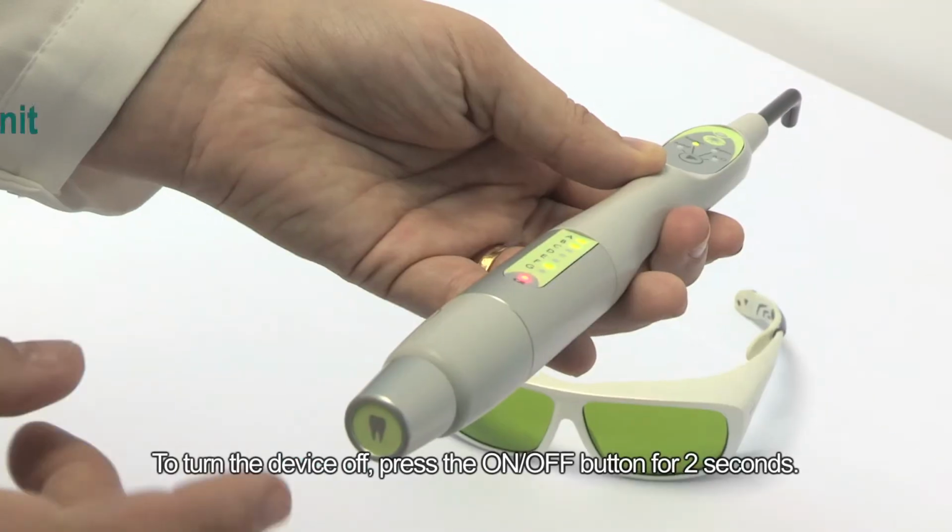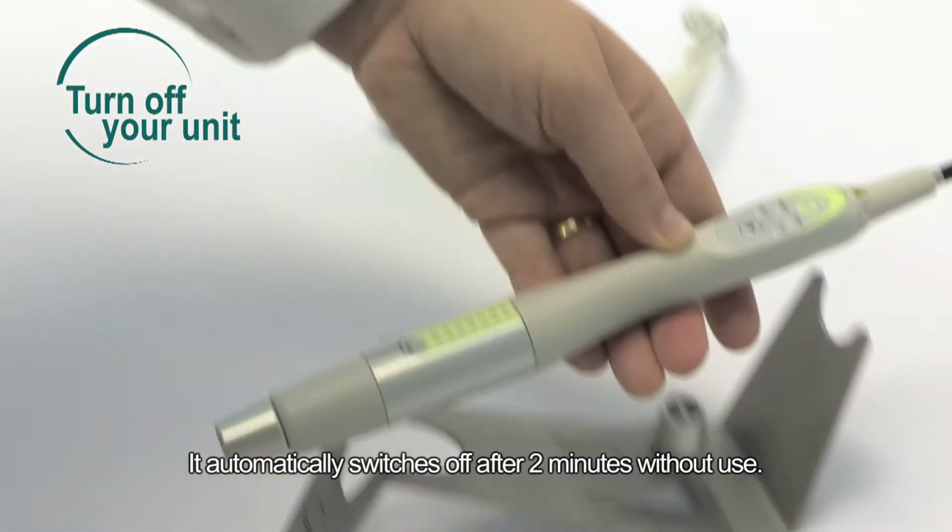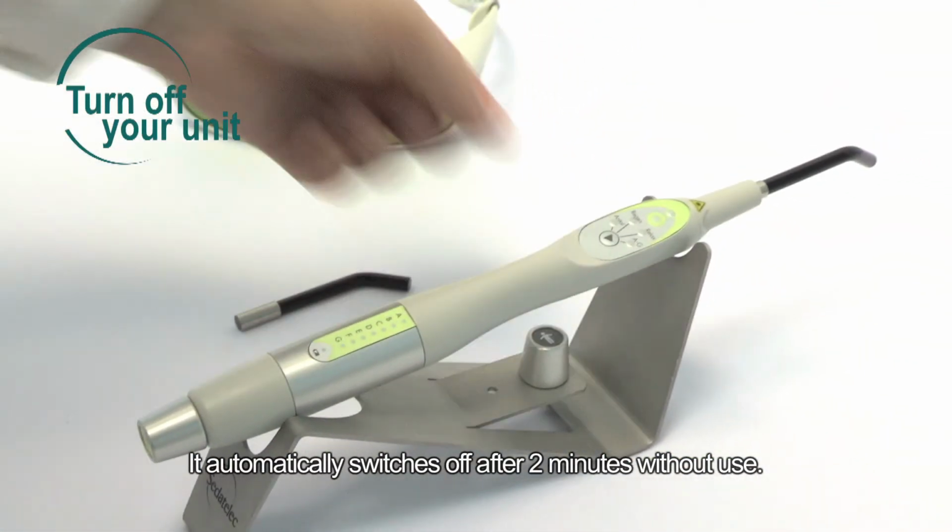To turn the device off, press the on-off button for 2 seconds. It automatically switches off after 2 minutes without use.